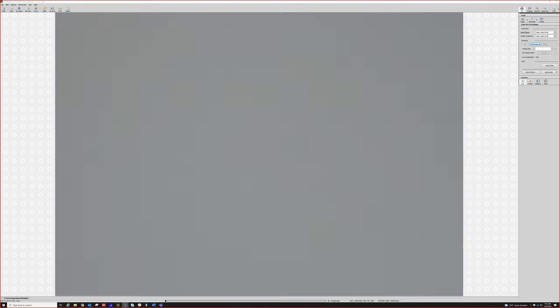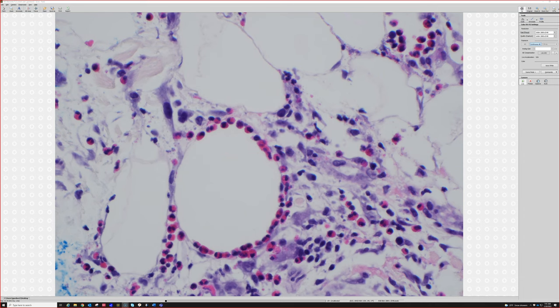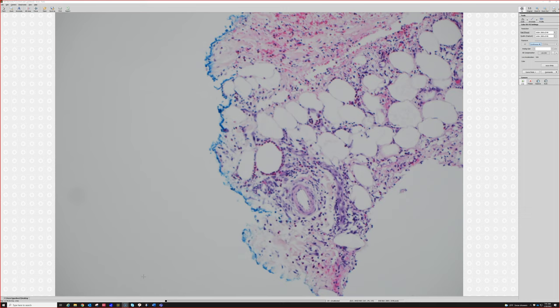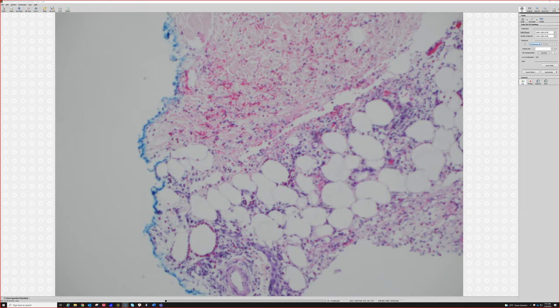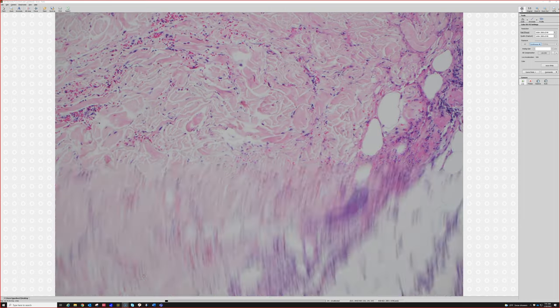Look at that — EOs all lined up around an adipocyte. Isn't that cool? I don't think it means anything, it's just pretty. All right, so lots of eosinophils, superficial and deep perivascular.